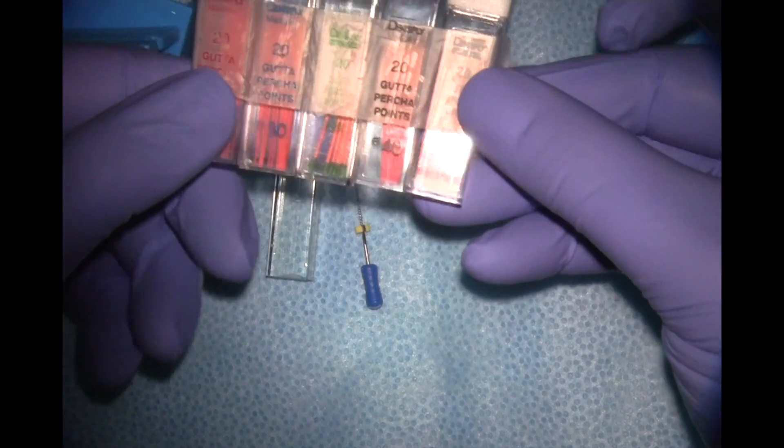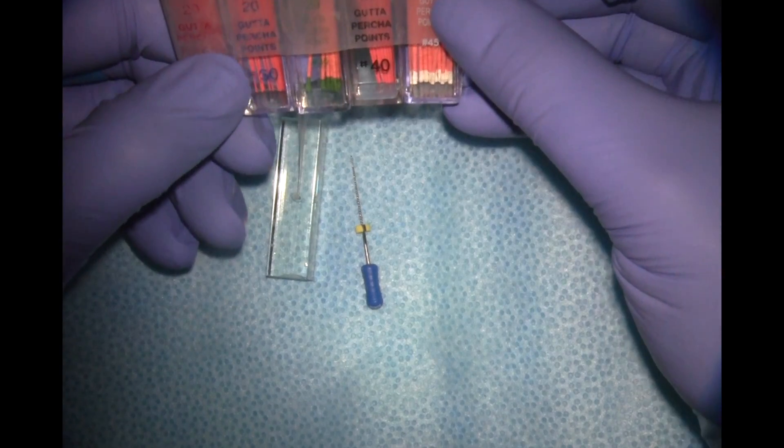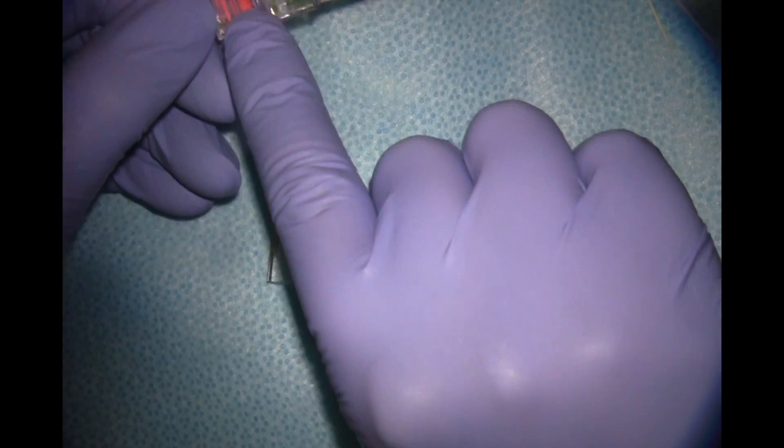Now that everything's dry, the next thing I'm going to do is a cone fit in the canal to ensure that my master cone is going to fit to my length. Your master cone is the largest cone you'll use during the cold lateral obturation technique, and its size correlates to the size of your master apical file. Since I had a master apical file of 30, I'm going to use a master cone of 30 as well.